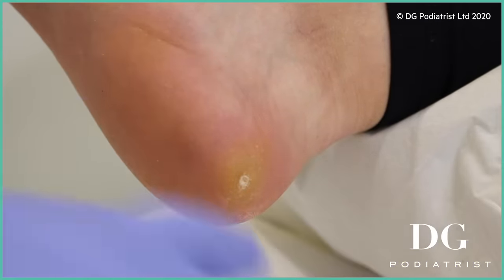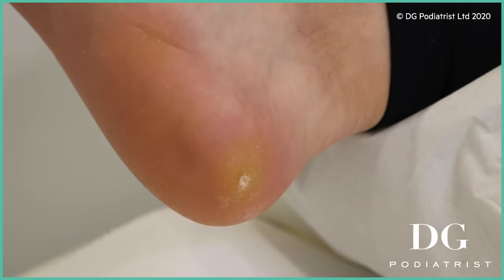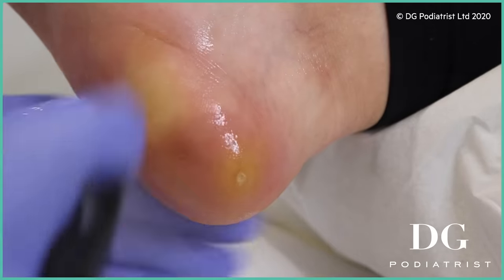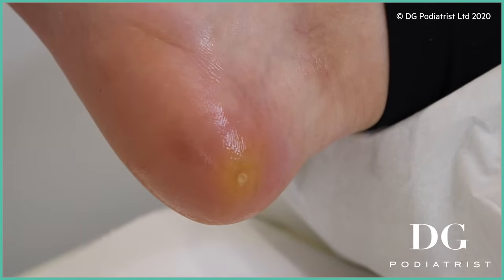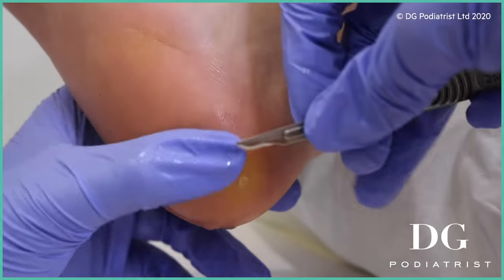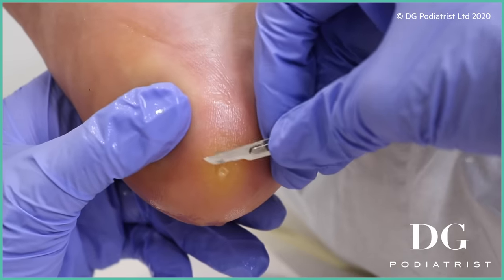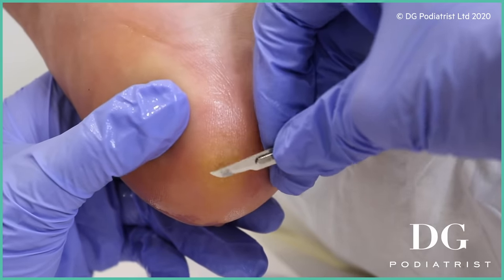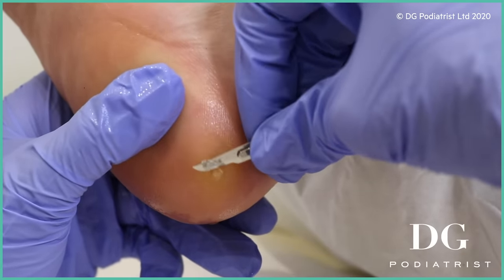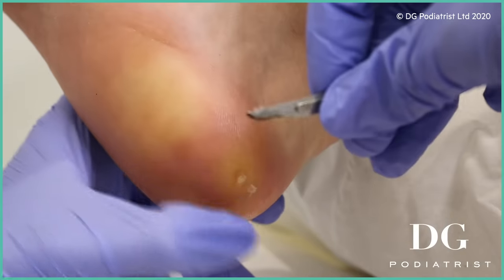So we're going to take this back. Similar to what you may have felt last time, but if it's uncomfortable at any point you just tell me and I will change for you. So just the antibacterial first. We actually do have a smaller version on the other foot too, but this side is definitely a lot larger. I don't know if you remember how it feels but I'm just going to start off very gently. Is that comfortable? It's okay, fine.